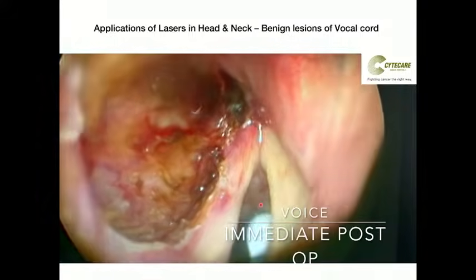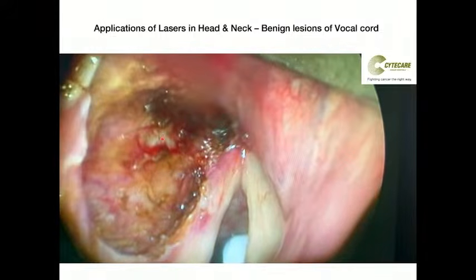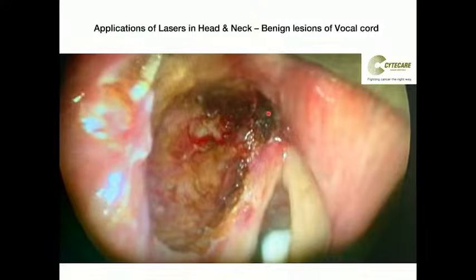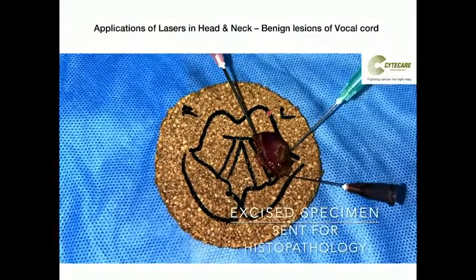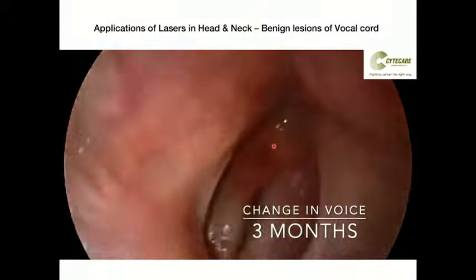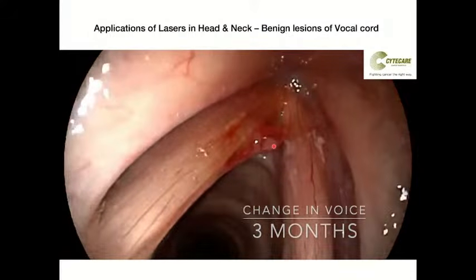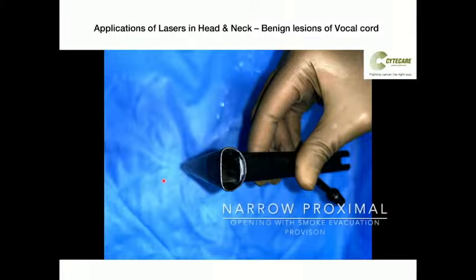We discussed in the first surgery the need to take pictures, because it is very important nowadays to show pictures to the patient. Otherwise, they will wonder what we have done. Also, for medico-legal reasons, we need to take documentation. You can see here the thyroid cartilage, a very extensive resection. And this was the NBI being done.